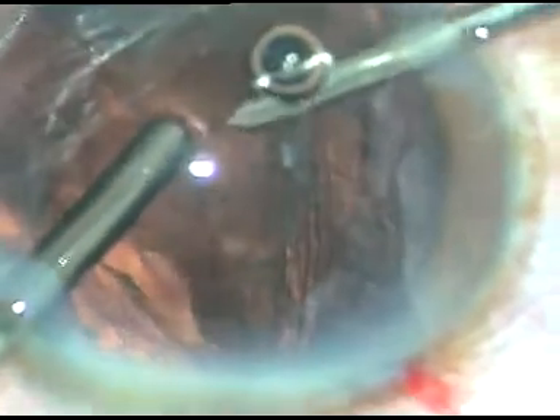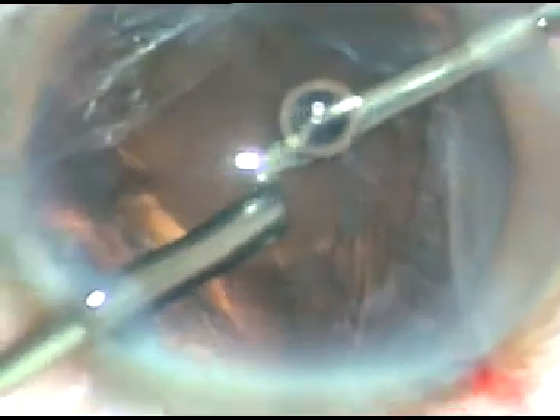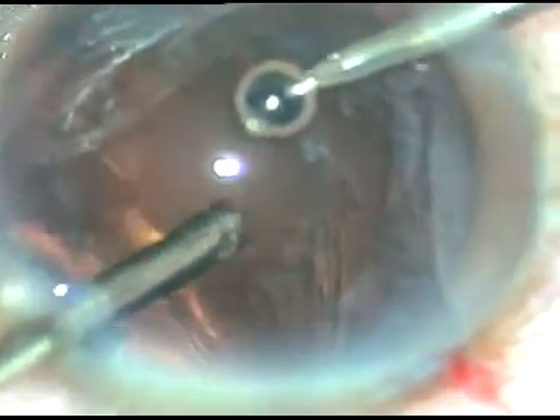Cutting first, then aspiration. The cut rate I used in this case is 1500 cuts per minute and the vacuum I used is 175. A lot of viscoelastic went into the anterior vitreous and has come out.